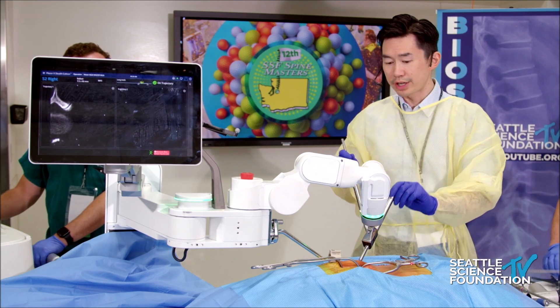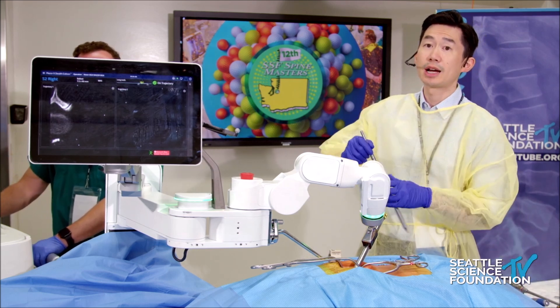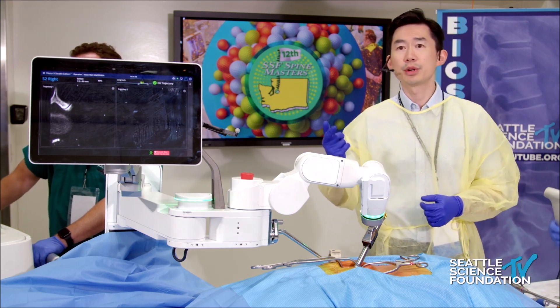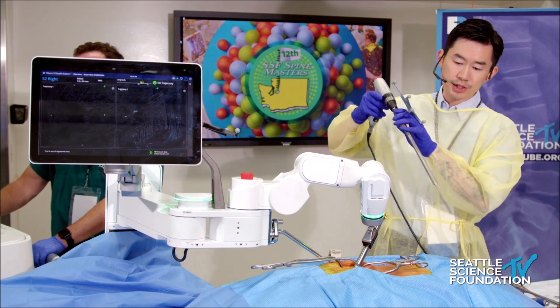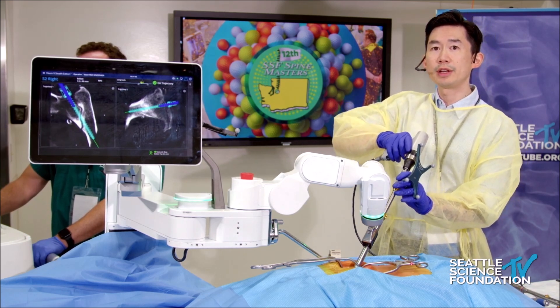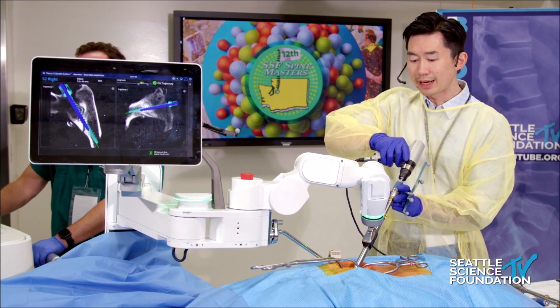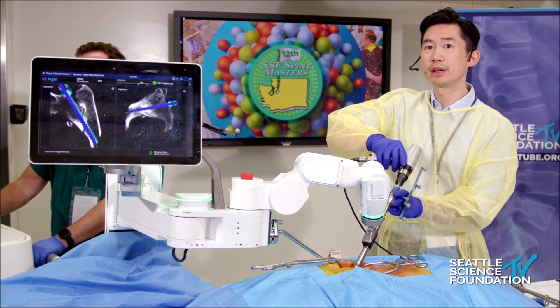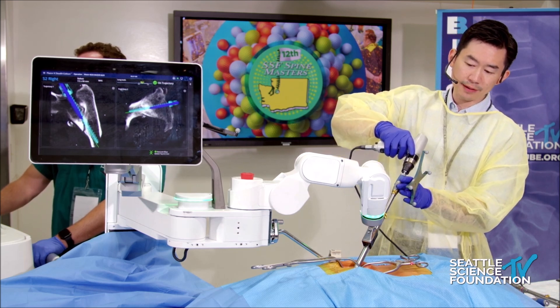Next is switching to a larger tap. Once that 4-5 or 5-5 tap goes in, I upsize to the next size tap, which is undersized. So if I'm using a 9-5 screw, I'll put an 8-5 tap; 8-5 screw, 7-5 tap, and so on. This is essentially the undersized tap that will go in just before the screw. You can follow on the navigation to make sure that you travel across that SI joint, and I essentially tap nearly the entire thing — especially if you're putting in a long screw, to make sure this is providing that path for the screw.